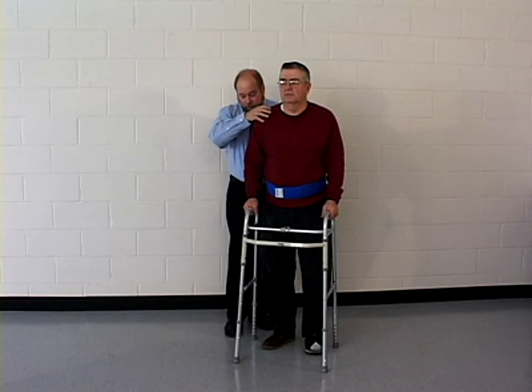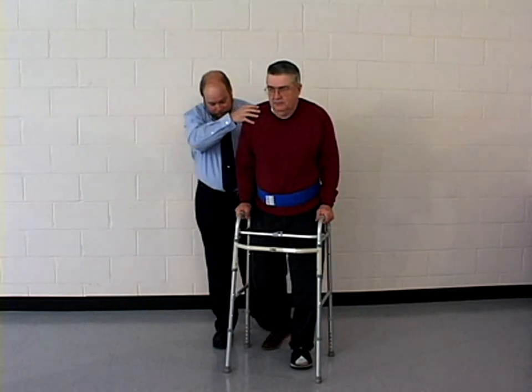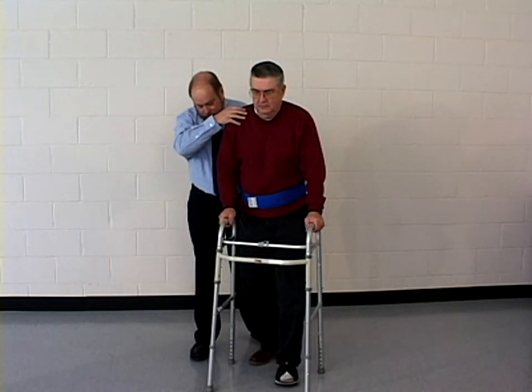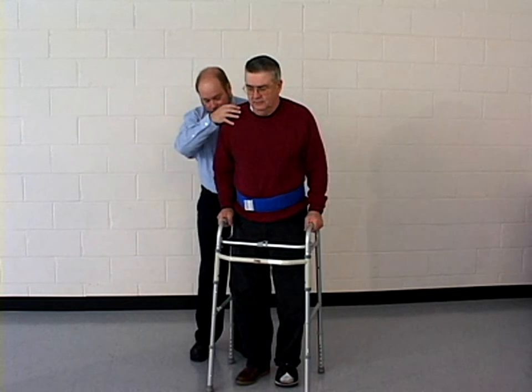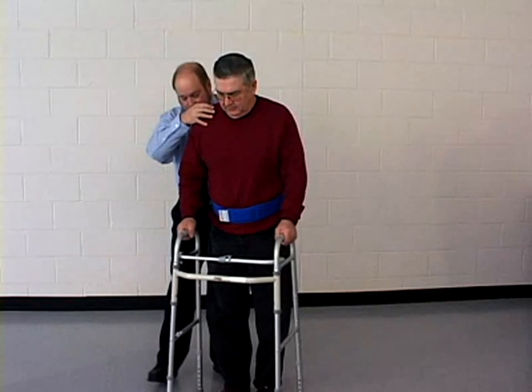Gait patterns define the sequence of moving ambulatory assistive devices and lower extremities so that patients can ambulate. In order for a patient using a walker to ambulate using a 3-point gait pattern, the patient stands centered within the walker. The physical therapist must be positioned in stride, behind and to one side of the patient. The therapist grasps the gait belt and the patient's shoulder.